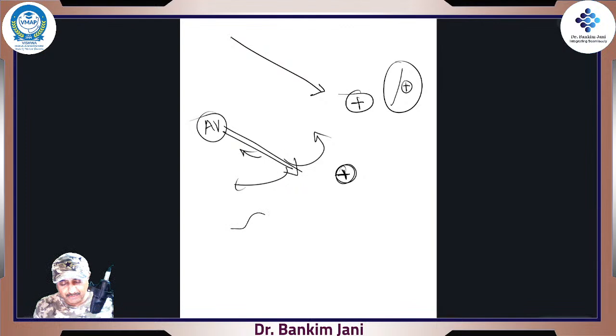The P wave is positive, it makes sense, but this slight dip and then plus, why this slight dip? Why should it really go down? Because the current is coming in large quantity towards this. So why should it really dip down? Now I know this dip is very negligible. It is very small. But technically speaking, why is our ECG never like this?